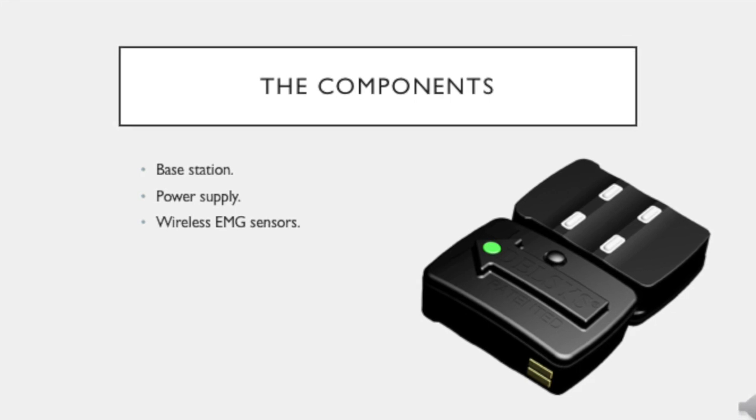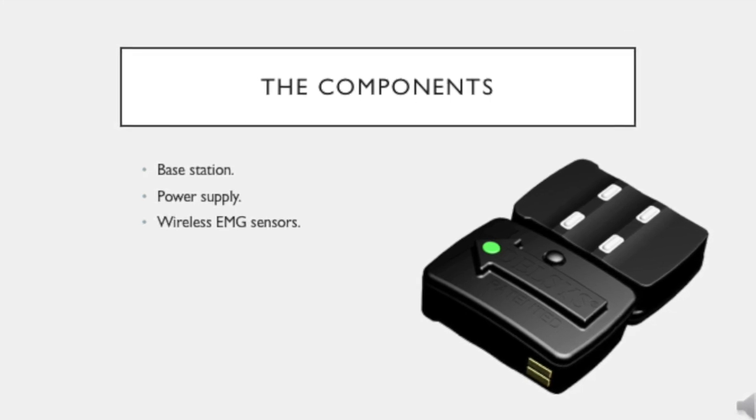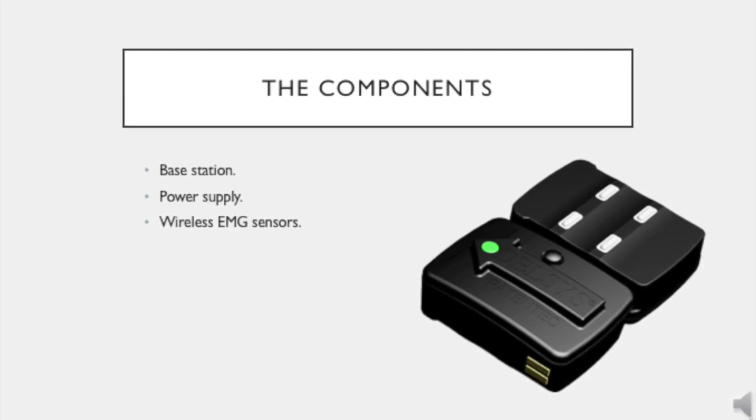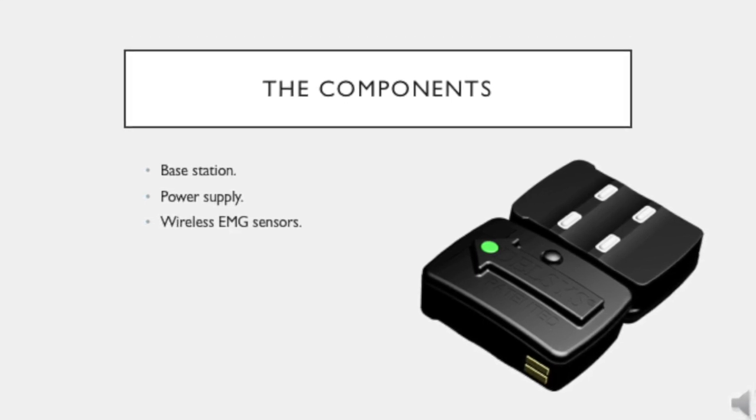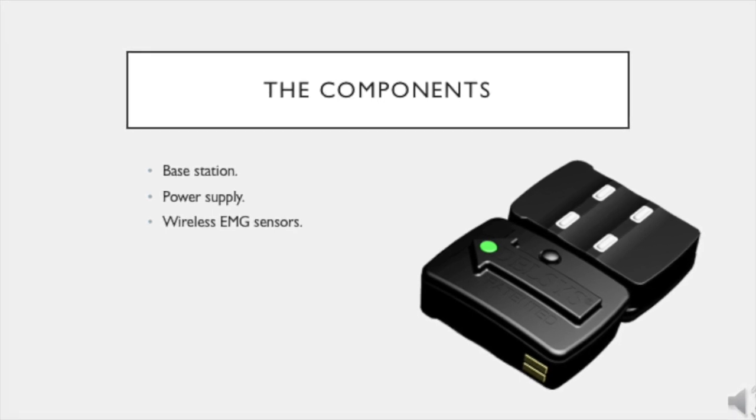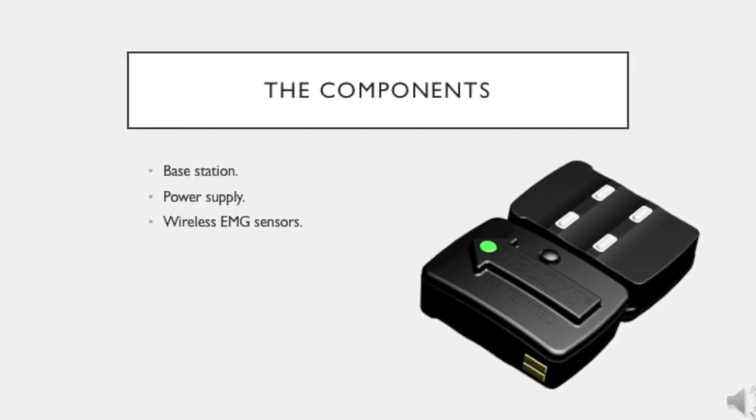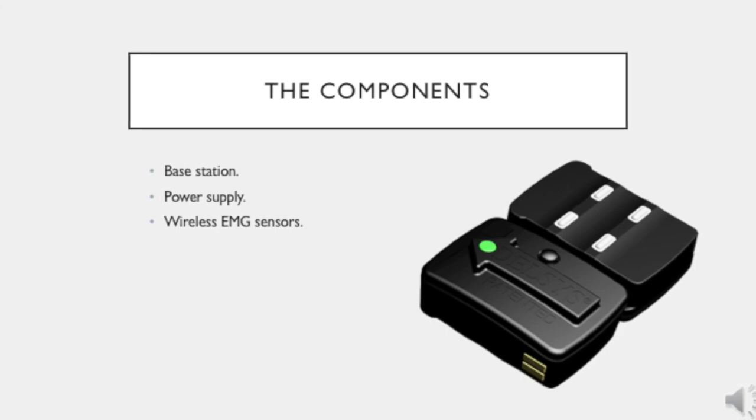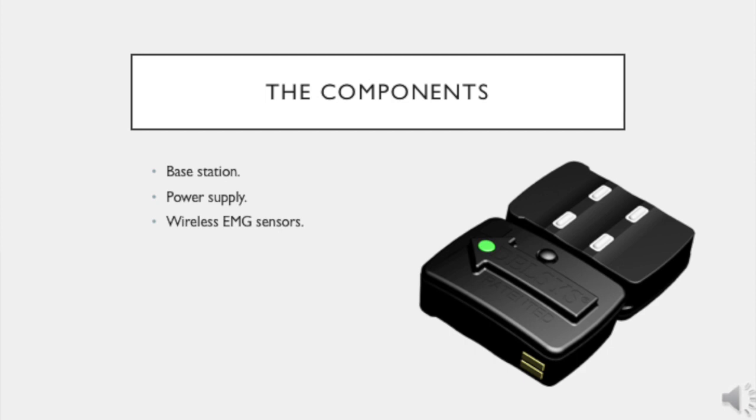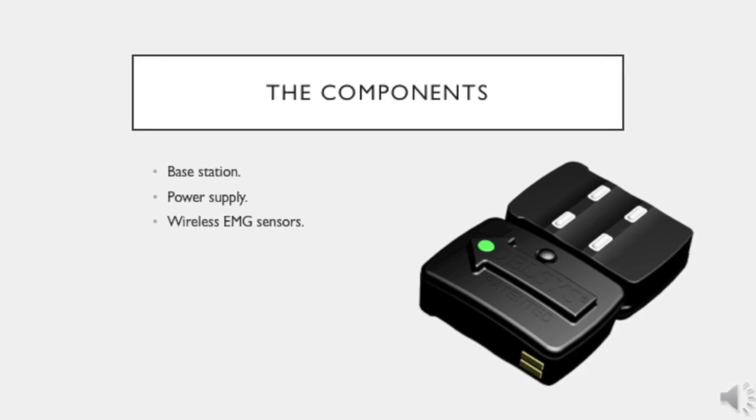When the sensor is turned on, the LED will turn green and it will begin to flash until it pairs with the base station. Once the sensor pairs with the base station, the LED will flash once per second to indicate that the data is streaming. The sensor will automatically begin to charge when it is placed in the base station. If the sensor is charging, the LED will turn amber.